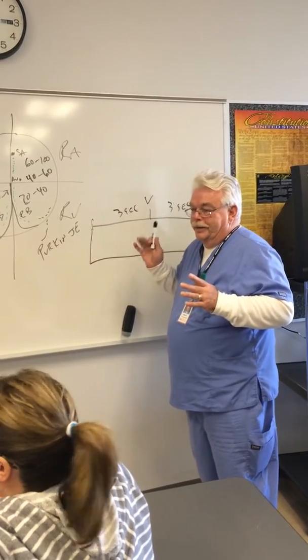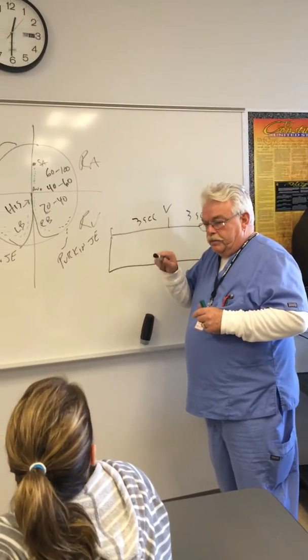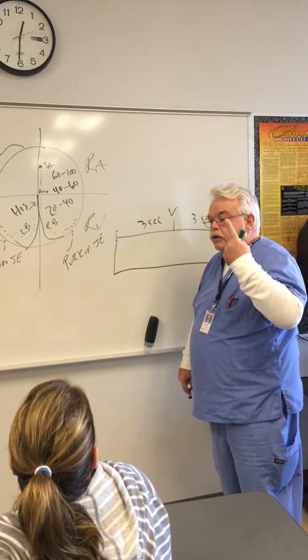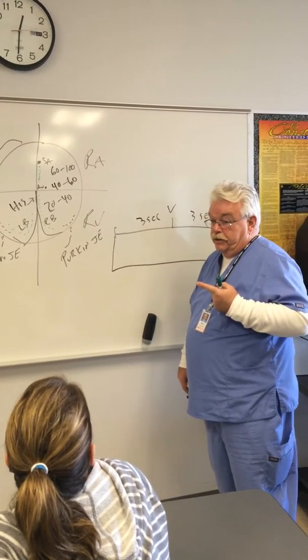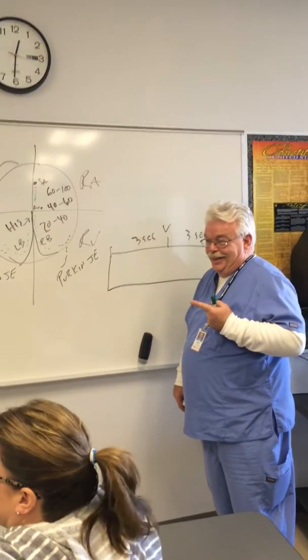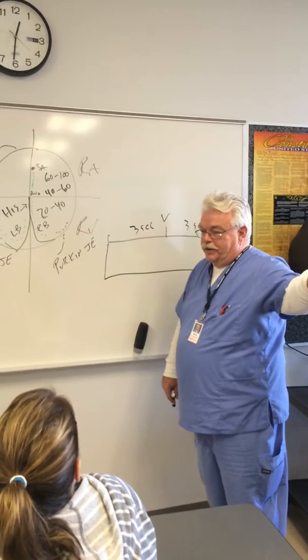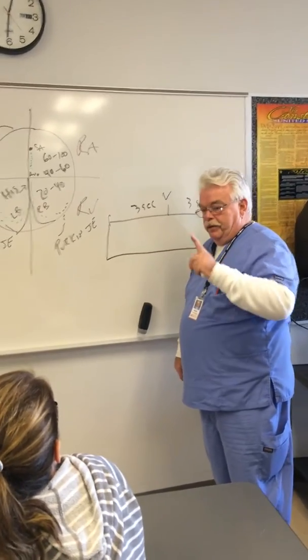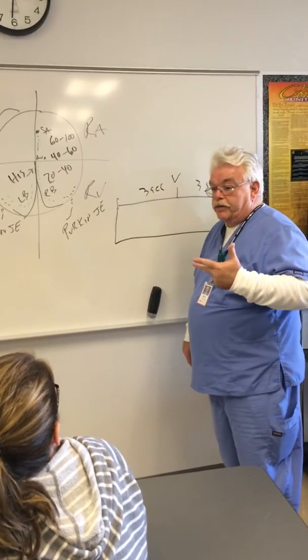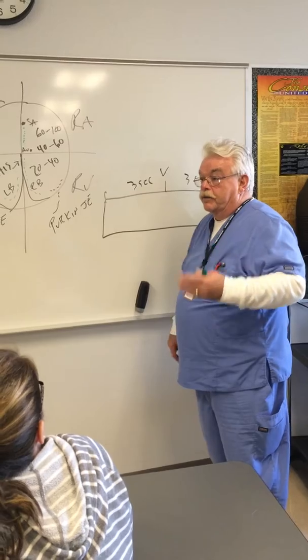We're getting there. Okay, is there a P wave before the QRS? Is there a P wave before every QRS is the third question you ask. 3A: is there only one P wave before every QRS? Correct, because then it could be a block. We're leading down the block path here in a second. Is there a P wave before every QRS? Yes. Is there only one P wave before every QRS? Yes. Is it regular? Yes. Is it between 60 and 100? Yes. What do we got?